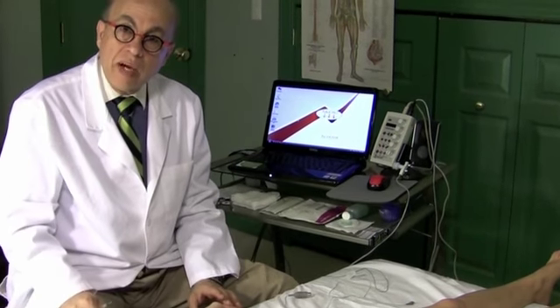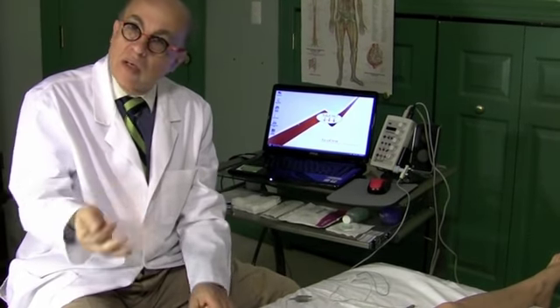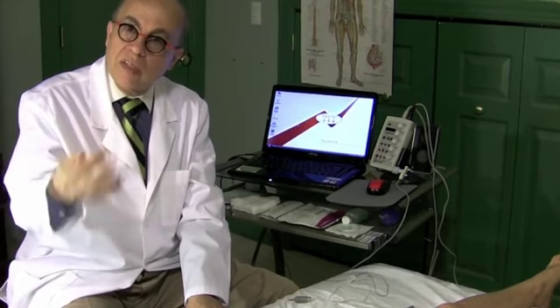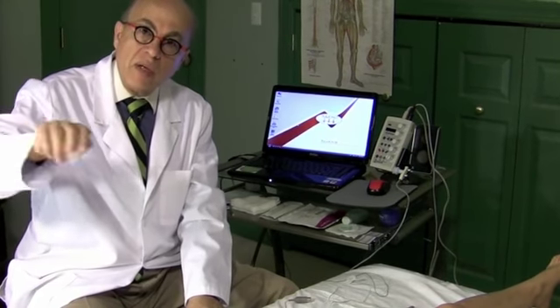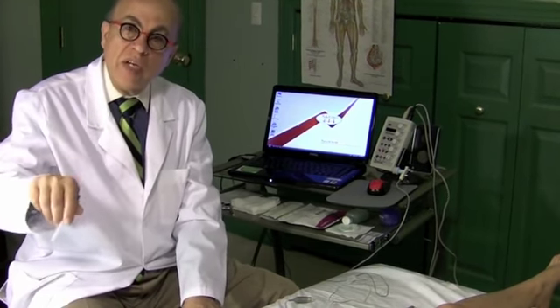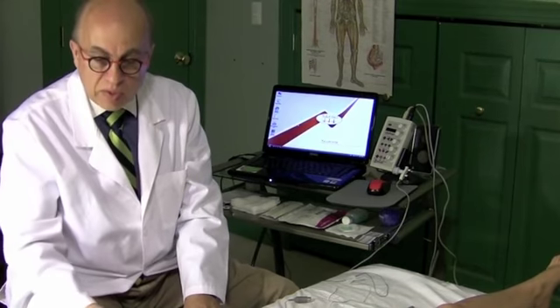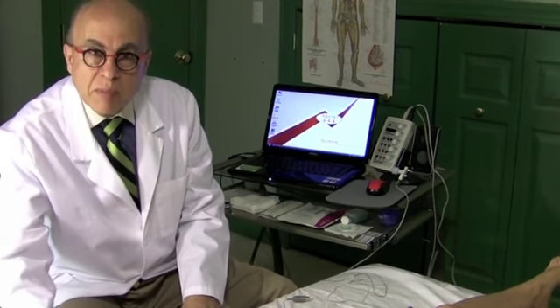And once we've done that, we move to the next muscle. We do exactly the same thing. Insertional activity in different areas. Because, you know, you might be over a muscle fiber that's still innervated. You want to see if you can get close to a muscle fiber that lost its nerve supply. We sample the muscle insertional activity in different areas. Then we go to mild effort, moderate effort, and full effort. When we're done with that, we go to the next muscle, next muscle, next muscle.